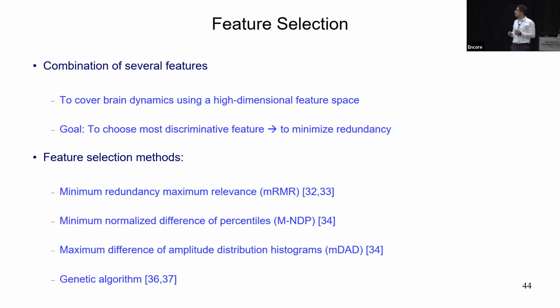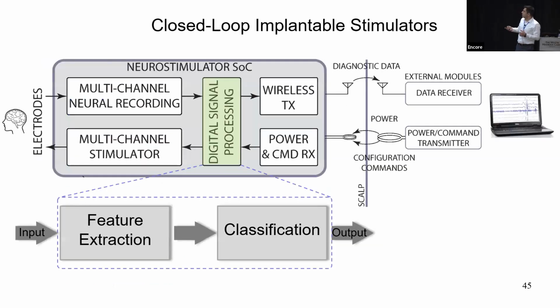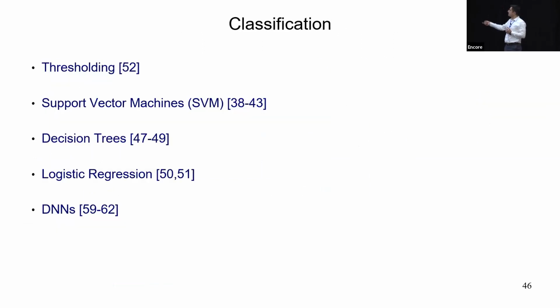They're kind of redundant. And the second part of seizure detection is classification. So let's talk a bit about the classifiers that are out there. The classifiers range from very simple thresholding methods that we saw a little bit before, and I'm going to show an example again, to different machine learning algorithms, to deep learning algorithms. I'm going to try to show different examples of these classifiers in the next few slides and talk about their pros and cons compared to each other.